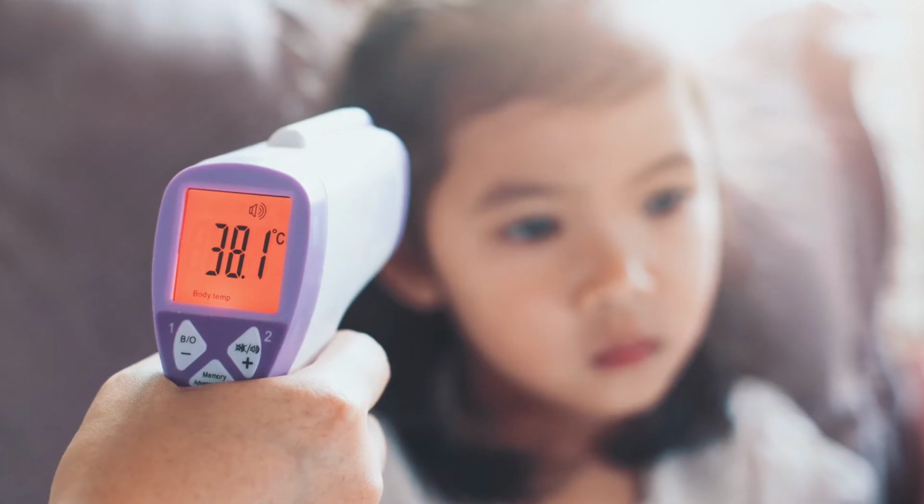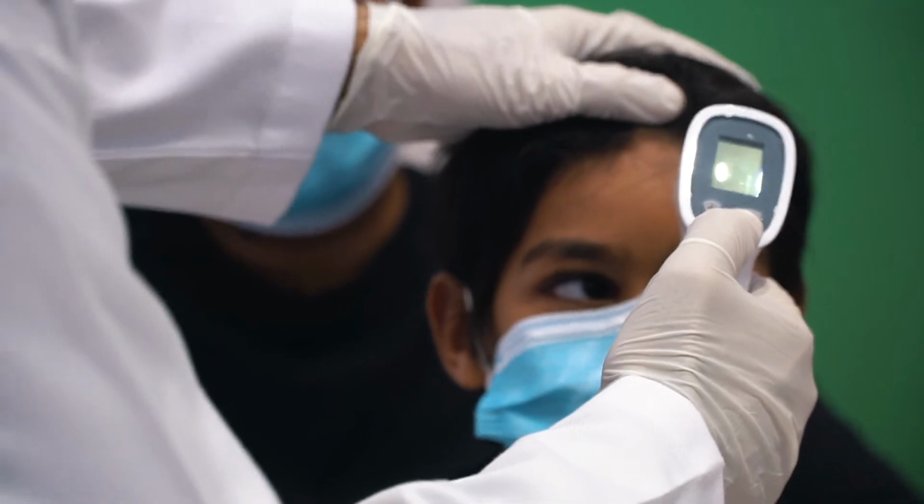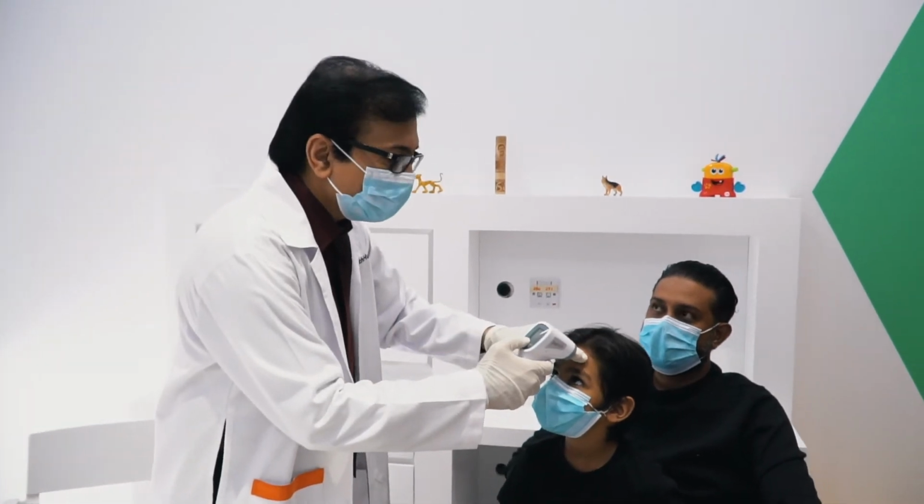The advantage of the forehead thermometer is that it is very fast, very quick, very convenient, and it is a non-touch method. As you know, it is the best thermometer for screening purposes. Nowadays we are seeing it in the airports, in the malls, everywhere everybody is using, and it looks like this. It is convenient, placed around 1 inch, 2.5 centimeters, away from the forehead, and you just need to press for a second, that's enough.